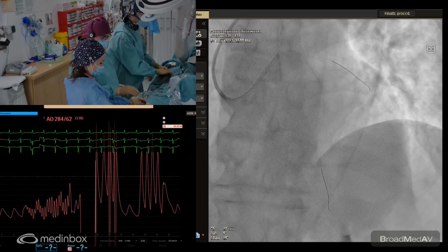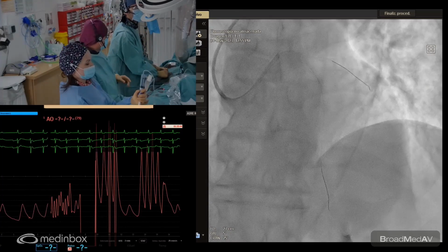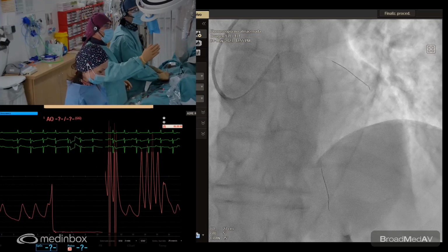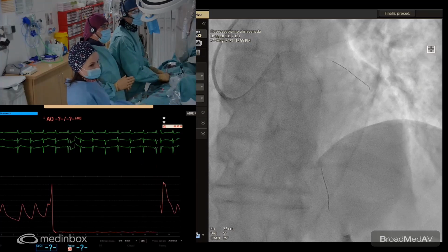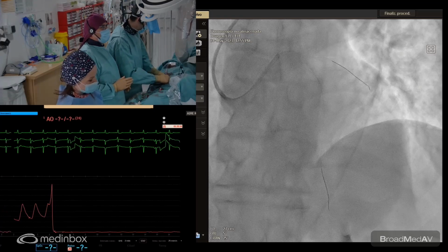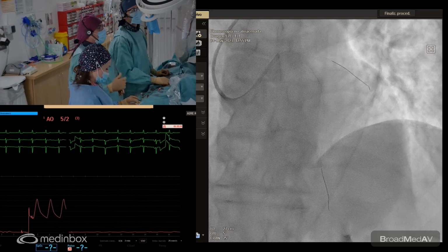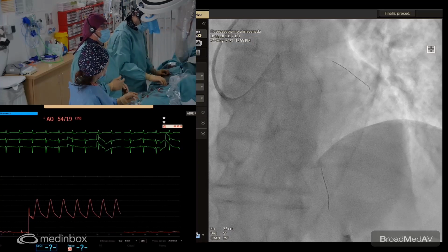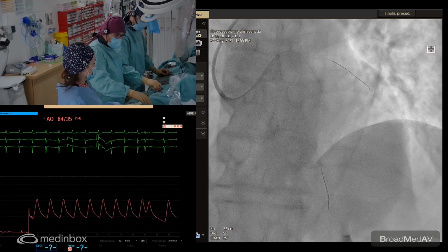Look at this. This is the proximal vessel, and the diameter is no more than 3. Let's see. The lumen, you mean? No, more proximal, Dani. This is the circ. Okay. So advance and there. There is 3. Now with the lumen it is 3.25. Yeah. Probably we can go to 3.5. Okay, I think so.